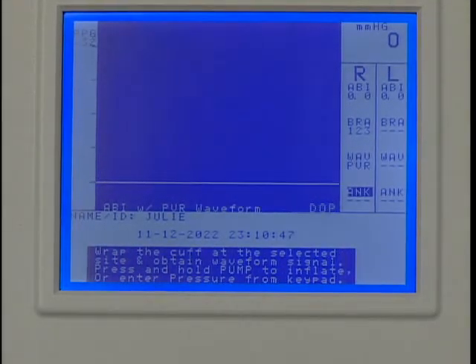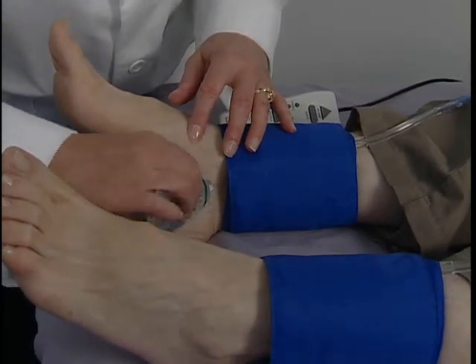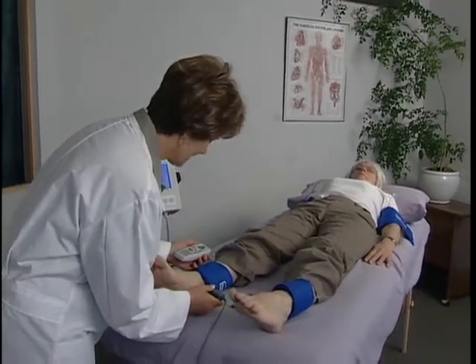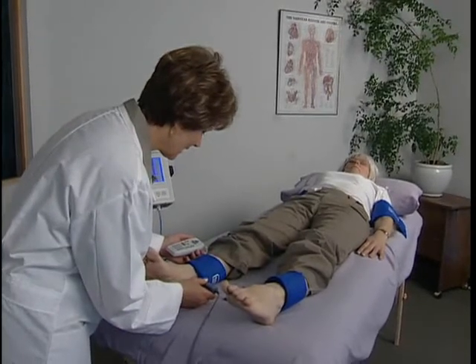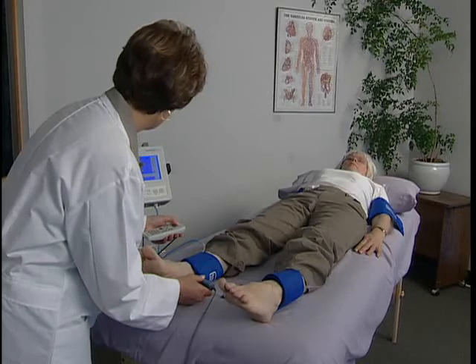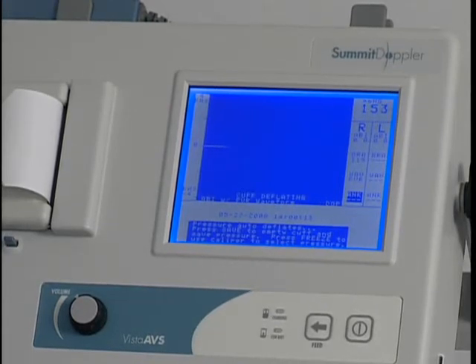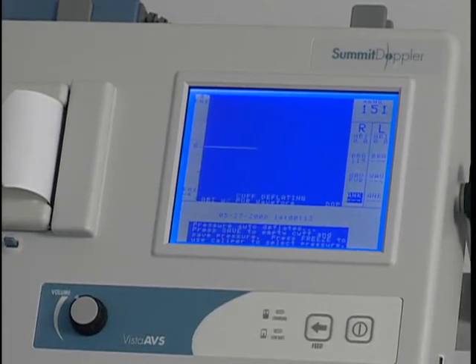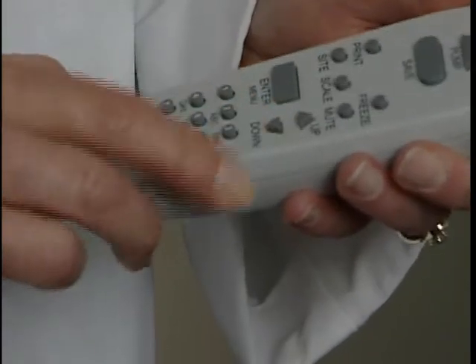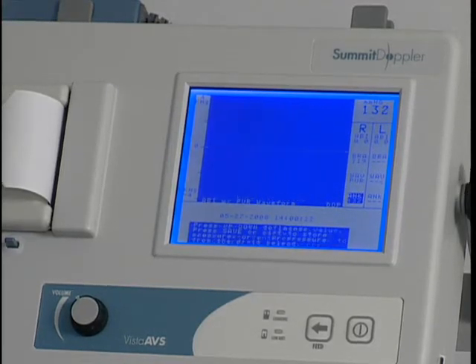Next, we'll obtain the ankle pressure using the Doppler probe. Apply gel to the posterior tibial artery and use the Doppler probe to listen to the blood flow while holding the probe steady on the artery. Press and hold pump until about 20 millimeters of mercury above the occlusion pressure. Release pump and the cuff will automatically begin to deflate. When you hear the first pulsation return, press Save and use the up or down key to adjust the pressure reading if needed. Press Save to record the systolic pressure and the marker will move to the next protocol location.